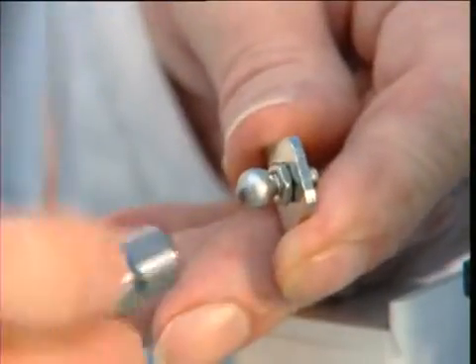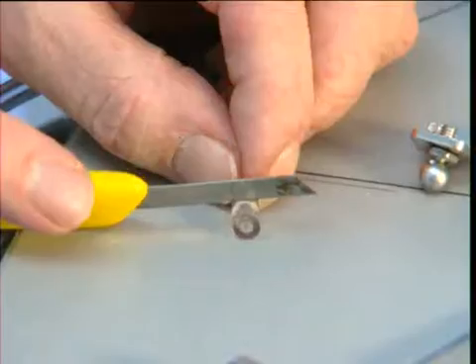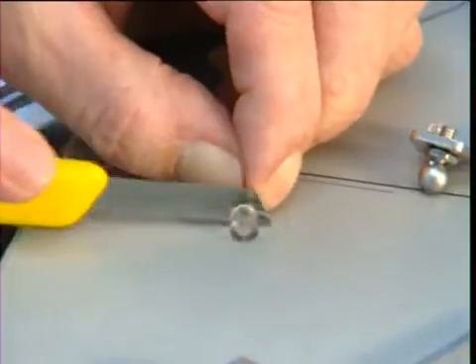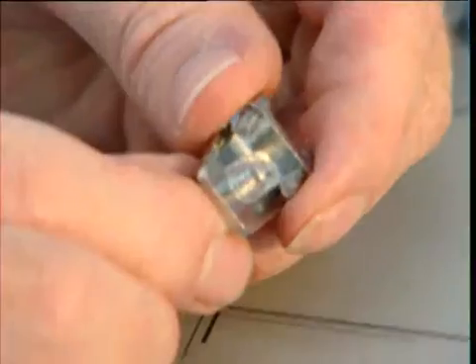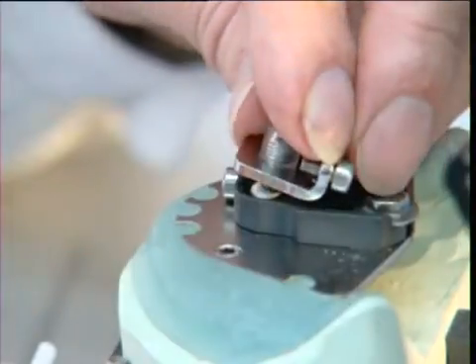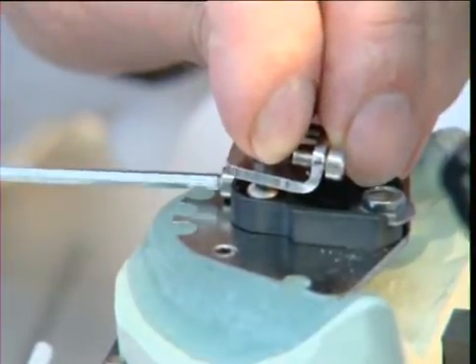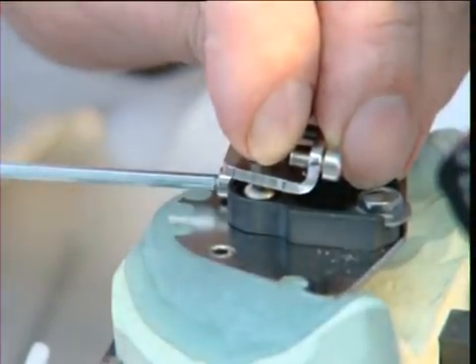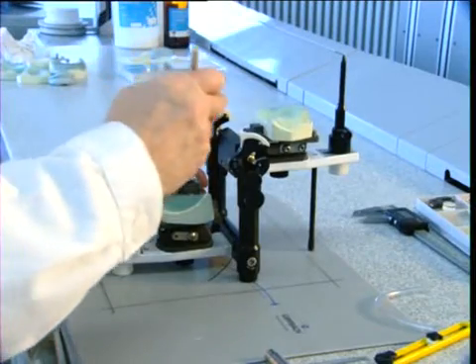A tracing ball is fitted to the pin holder and a short piece of plastic tube slipped over the protruding section of thread to act as a spacer. The pin holder and tracing ball are then fixed to the alignment clamp and the vertical dimension adjusted with the thread of the tracing ball. Here too, the Allen screws are coated with separator.